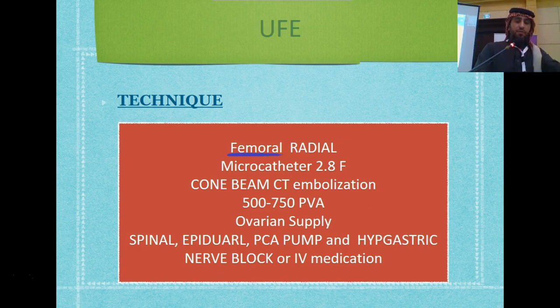This is different than postpartum hemorrhage, where this is a pure elective procedure. In the old days, we were puncturing the femoral artery, only one side. Some groups puncture both sides, both femoral, but we stayed and kept puncturing just the one side. Nowadays, we have shifted from femoral to radial because the patient can mobilize immediately. Vascular complication is less.